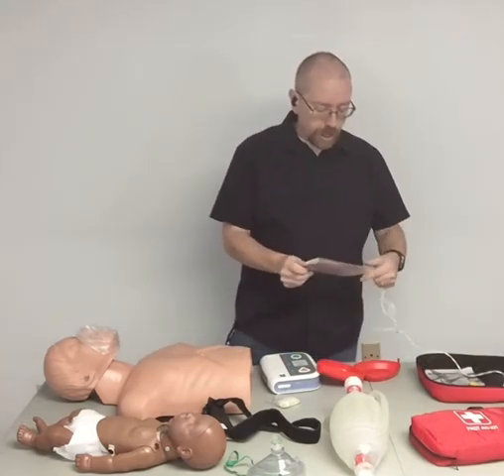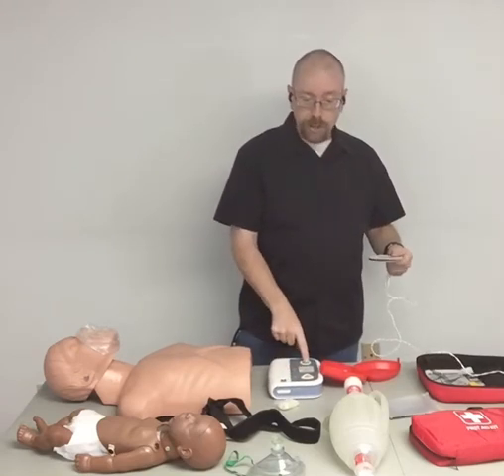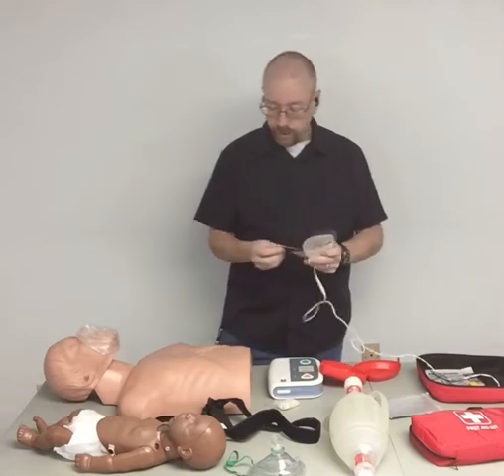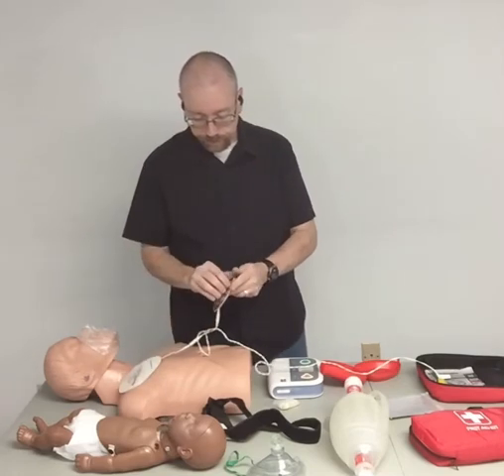So the first step for using the automated external defibrillator is to turn it on. And just listen to it. Apply pad to patient's bare chest. Plug in pads connector next to flashing light.